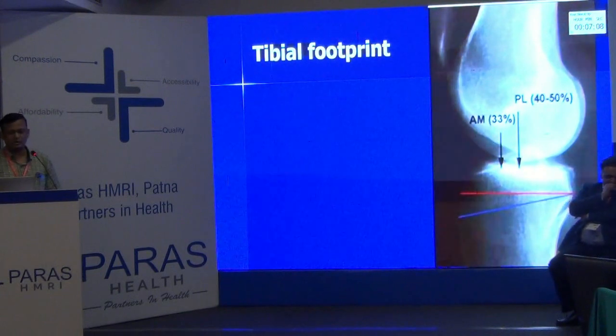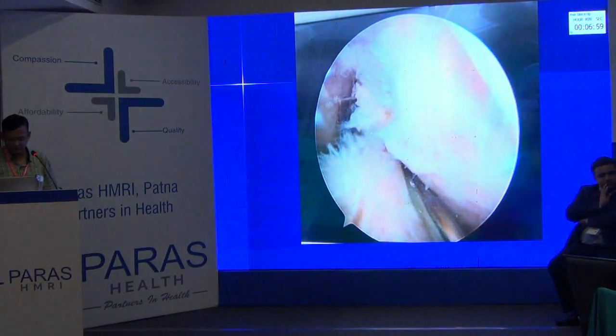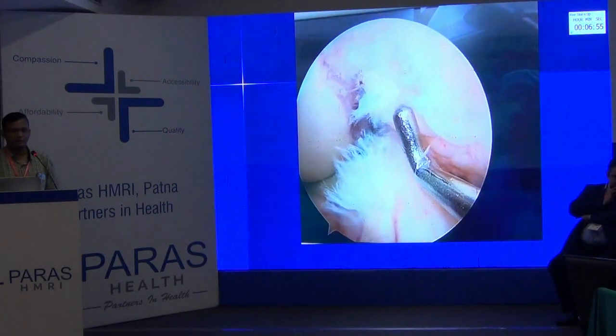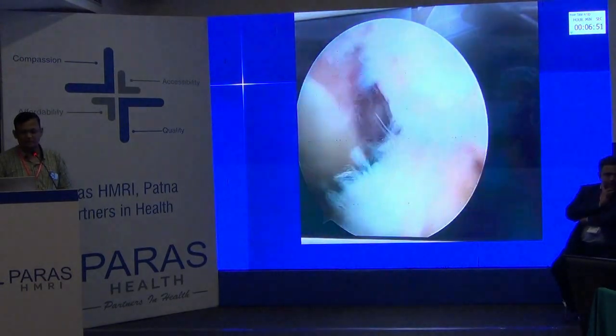But what is more important is your entry border of the tunnel should be behind your Blumensaat line in full extension, in full lateral view. So with this, I would like to just show this video, a small video. As you can see here, I usually prefer to reproduce the footprint both on the femoral side and tibial side.